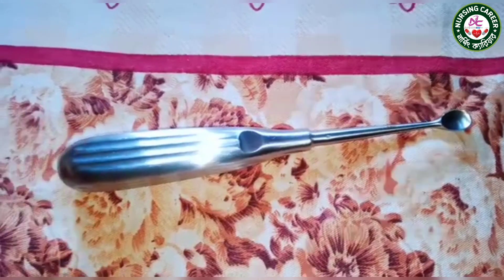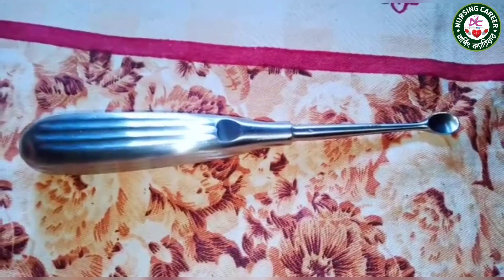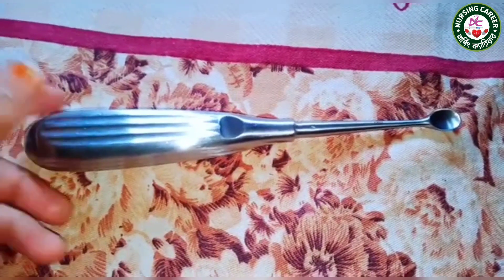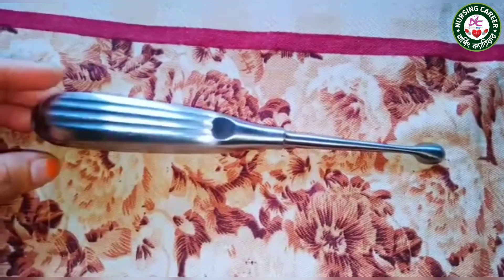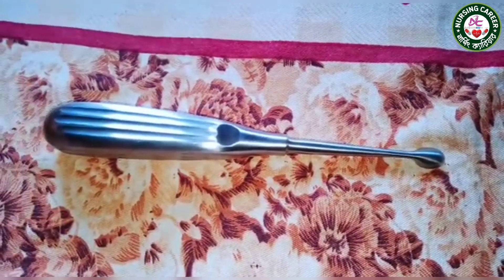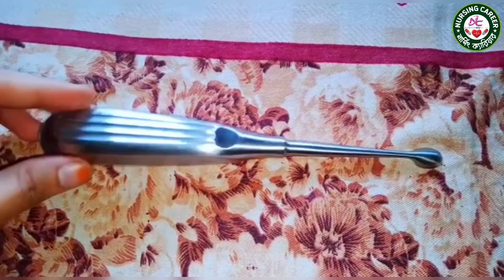This is a bone curette. This instrument is used to carefully smooth and shape the bone.